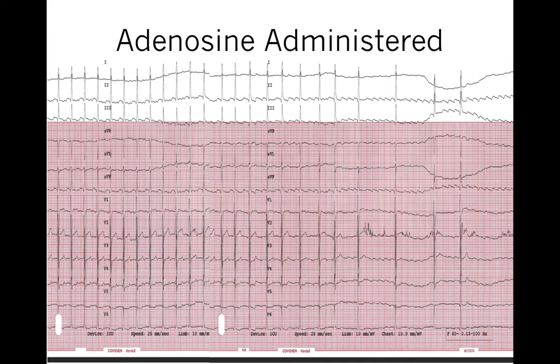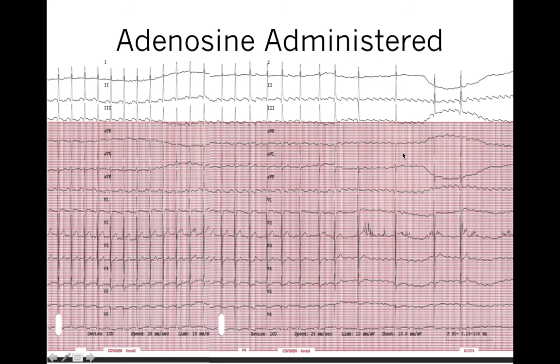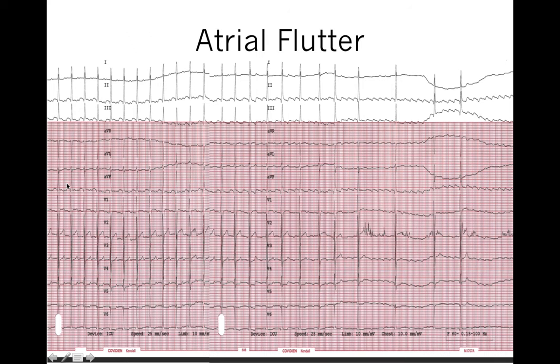Adenosine is given with transient block of the AV node. The tachycardia is going, then there is AV nodal block — and if we were to continue, the tachycardia resumes just like before. However, during this pause, you see a sawtooth pattern in the inferior leads. So the answer is atrial flutter. This is atrial flutter with 2-to-1 conduction; it's simply difficult to see the flutter waves when the heart rate is so fast, but when you block the AV node, it's easier to see the flutter waves.